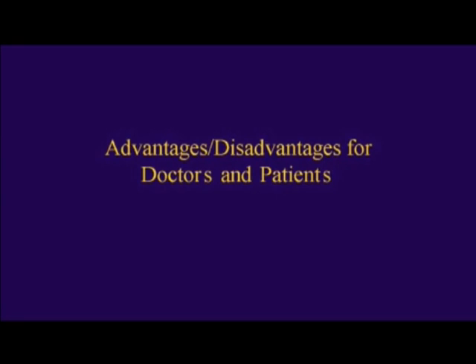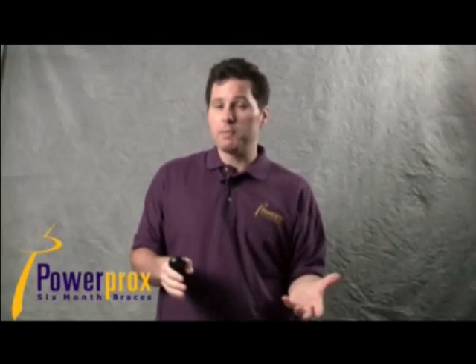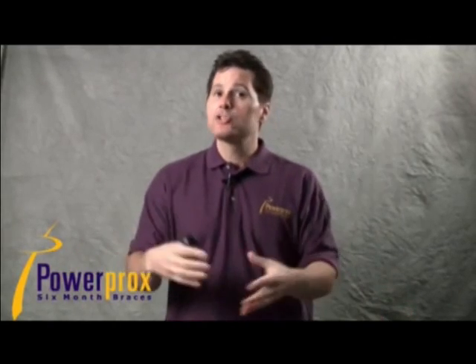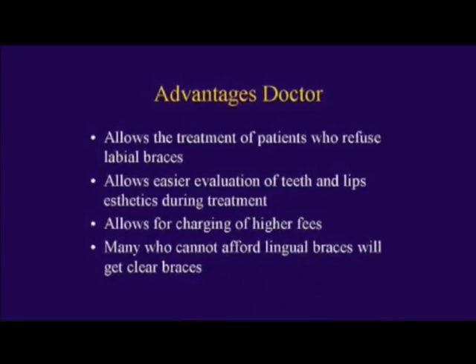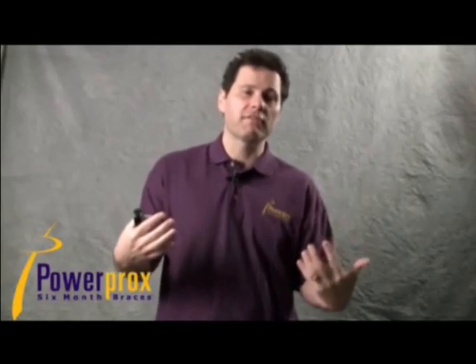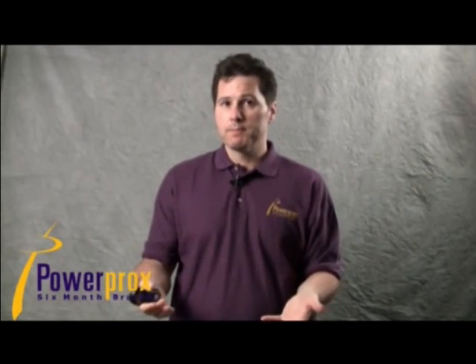Now, obviously, there are going to be pros and cons for the doctors and the patients when using lingual braces to straighten teeth. For the doctor, again, it will allow the treatment of patients who absolutely refuse labial braces. And there's going to be some that won't wear braces on the outside. So now you have another option you can give these patients. Also, it really lets you view what your final result's going to be, obviously, because there's no fixed hardware on the labial surface of the teeth. You get to see your final result before you remove the braces.